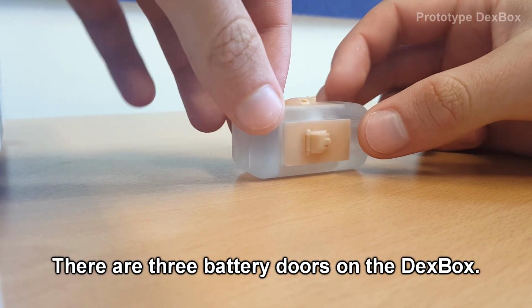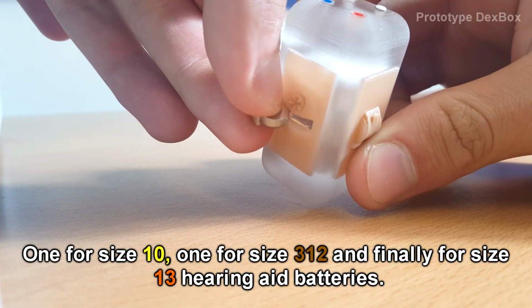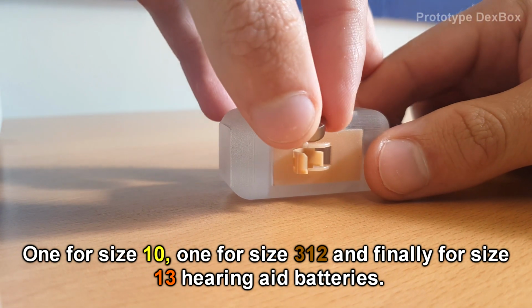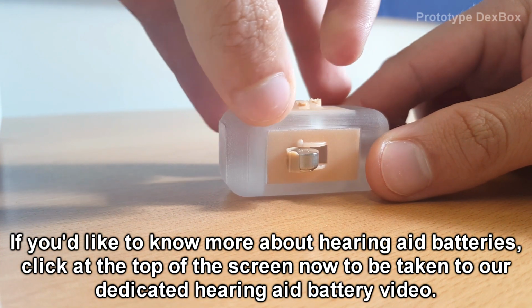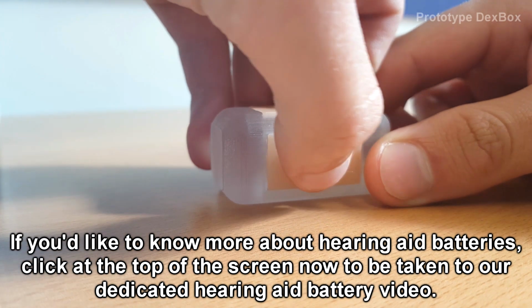There are 3 battery doors on the DexBox, one for size 10, one for size 312, and finally for size 13 hearing aid batteries. If you'd like to know more about hearing aid batteries, click at the top of the screen now to be taken to our dedicated hearing aid batteries video.